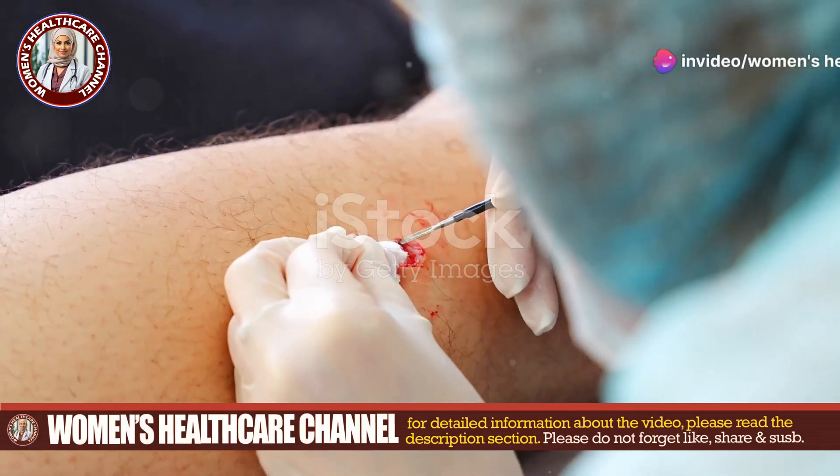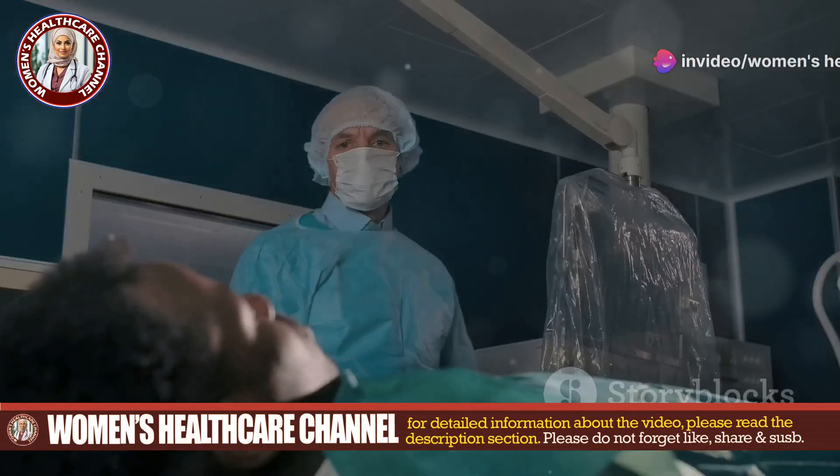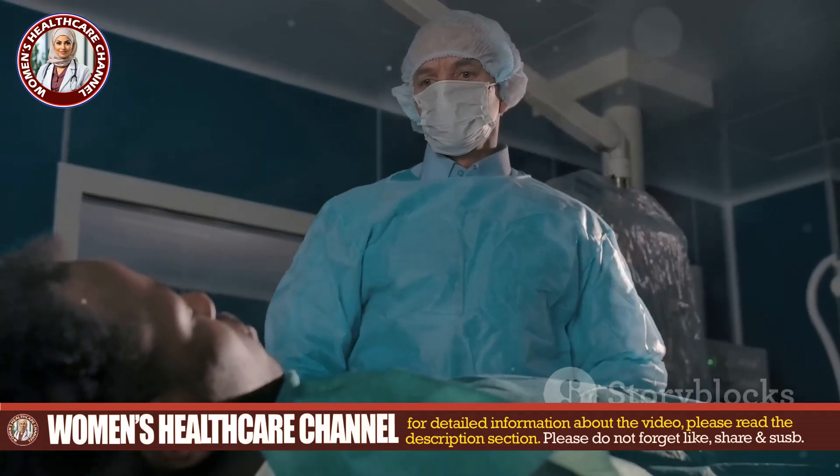Furuncular myiasis caused by the human botfly Dermatobia hominis can be a real pain, literally. But don't worry, we've got a straightforward method to help you extract that pesky larva intact.